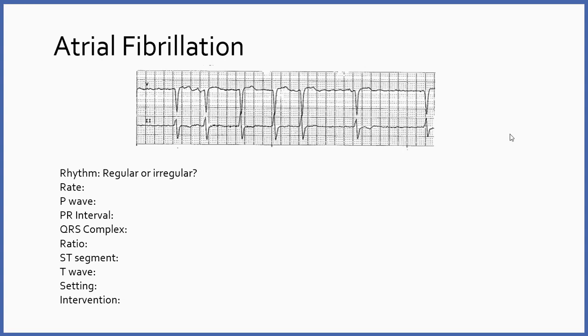Now, just AFib in general, this is actually a relatively common dysrhythmia. It can be acute or chronic. We'll be talking more about this in class. We'll talk about the difference between the two and treatment management options. Always assess your patient to determine whether they're hemodynamically stable. If not, we have to fix that.